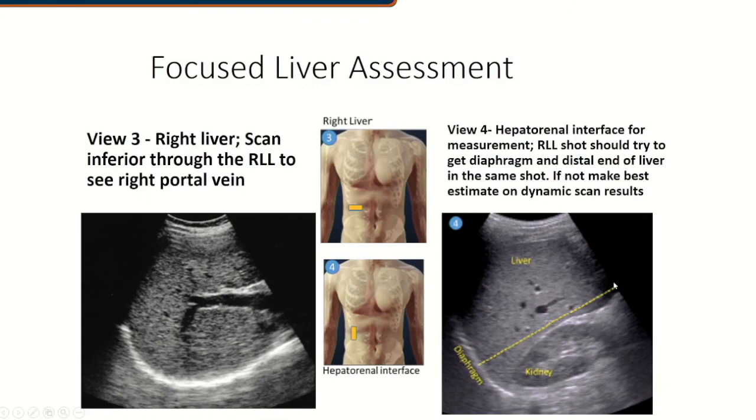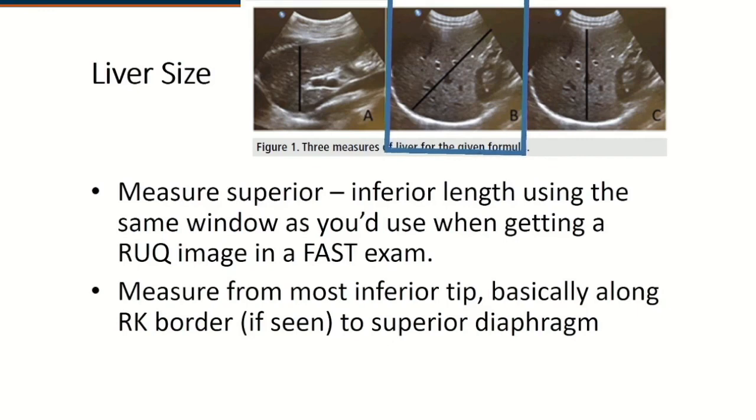Now notice that these cards each have a single scan plane, and you must remember that you have to look at everything in both scan planes. And I want to just remind you that liver size really is most accurate when it is calculated as a volume, but sonographically we rely most heavily on the length of the liver to assess normalcy.